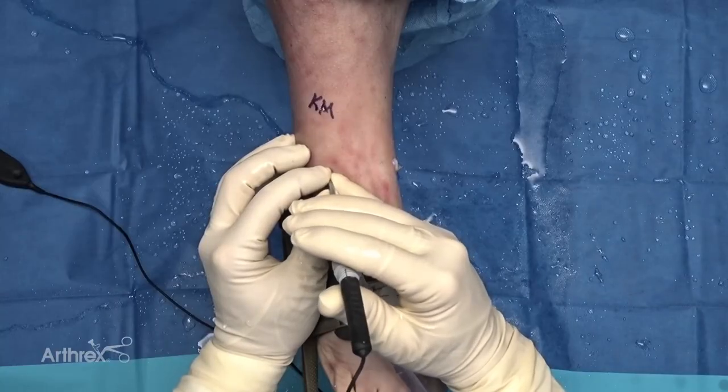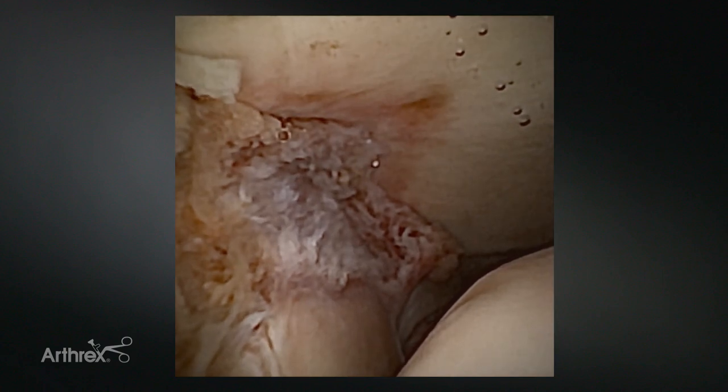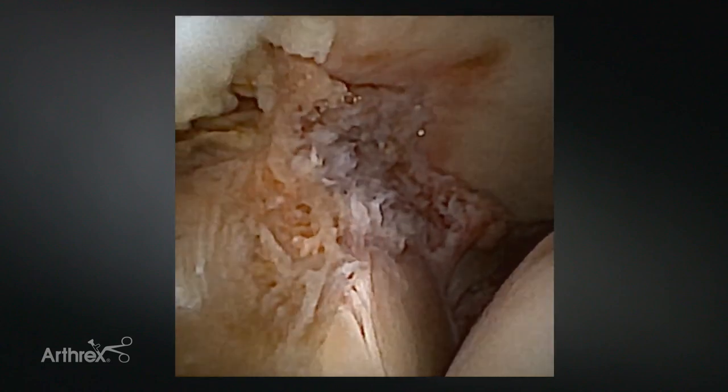Now we're viewing from the anterolateral portal. When looking for syndesmosis reduction, our trauma colleagues will often say they directly visualize their syndesmosis reduction — I would argue they do not. You need this view looking at the fibula, talus, and tibia, getting this Mercedes sign right here, truly ensuring the syndesmosis is reduced. That's why nano needle can be so integral in fracture cases and trauma.